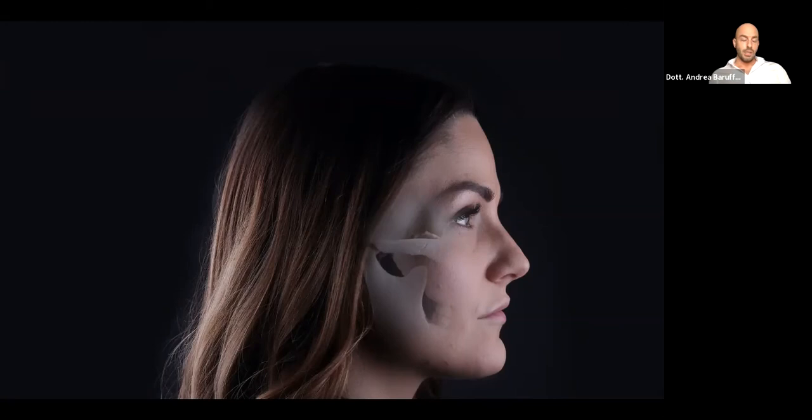And for the temporal, we have to identify the major axis of the zygomatic process of the frontal bone and apply the probe along the muscle anterior margin. We stay close to the coronal suture, keeping about 2 centimeters from the zygomatic process, in this way.